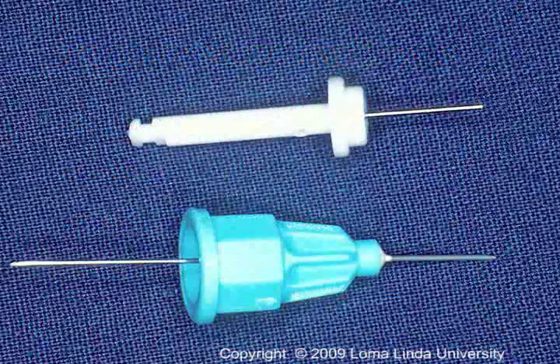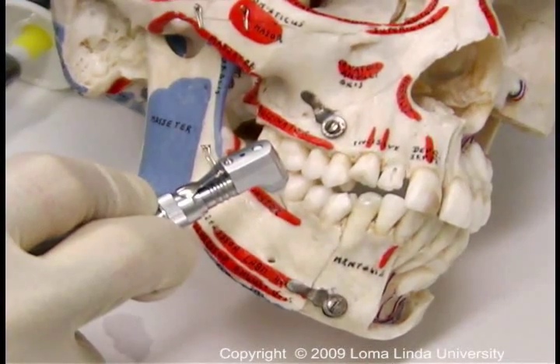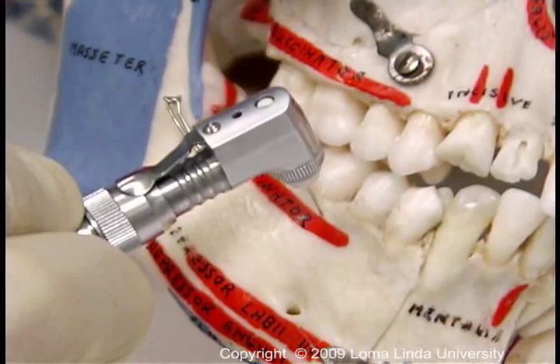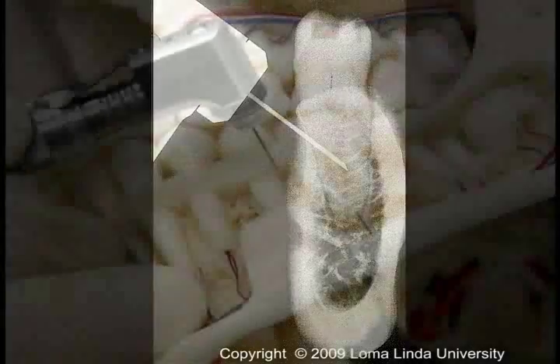There are commercially available devices from Stabident. The perforator and a matching ultra-short needle are shown here. If the premolar is to be anesthetized, the perforator is positioned at approximately a 45-degree angle to the bone. After penetration, the perforator tip drops into the medullary space.